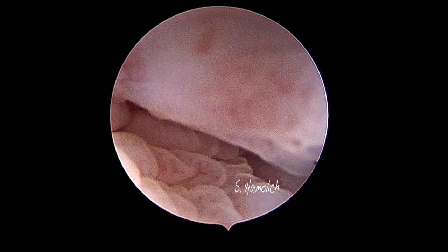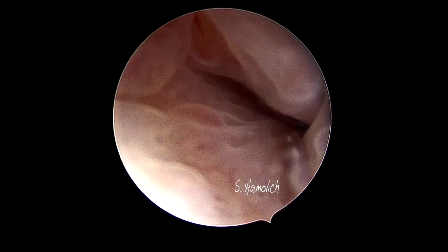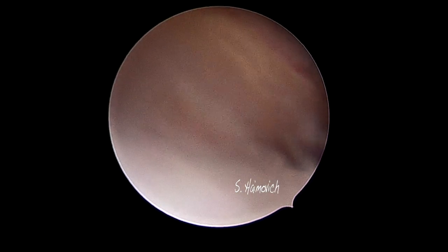IUDs are a very popular contraceptive method. Among the different types, T-shaped are the most used. It is not infrequent, during a hysteroscopy, to find this kind of IUD retained in the cavity with no strings or even broken. This is a case of a broken T-shaped IUD.